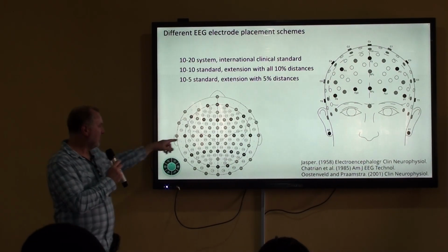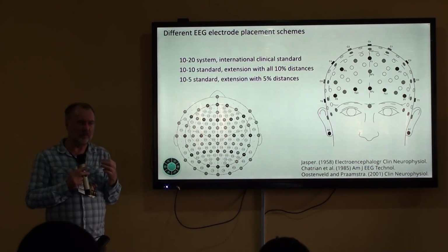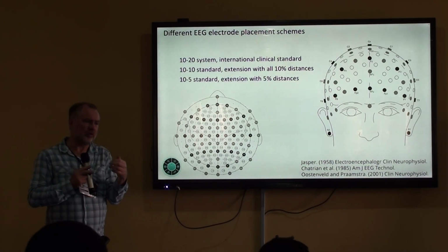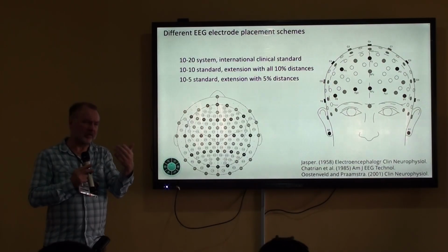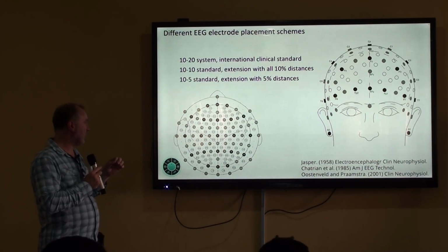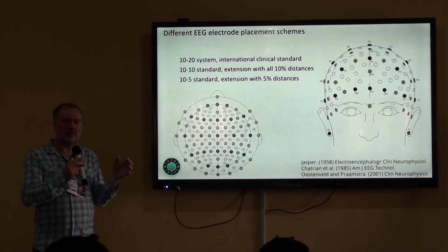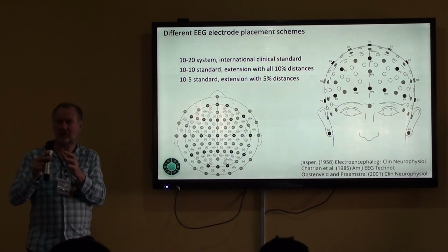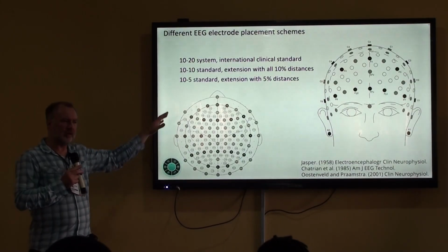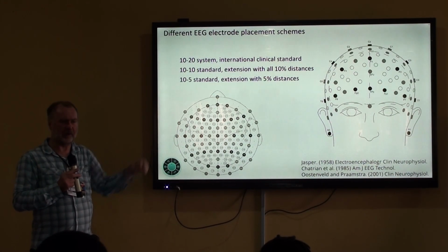In a way, the placement of the electrodes is obvious. The naming of the electrodes is what is really important, because what you do during practical application of the cap, at a certain point your EEG amplifier, if it has the feature, is going to show the impedances, and then it's going to tell you that the impedance on the electrode, let's say CP5, is not good. And then you have to turn to the participant and you have to find electrode CP5, because that requires a little bit of extra attention. So knowing these names of these electrodes in your cap is important, because that's what you need during the application of the electrodes.